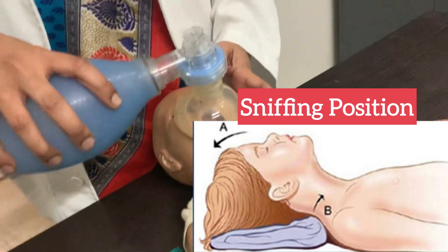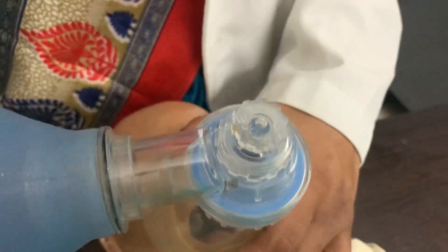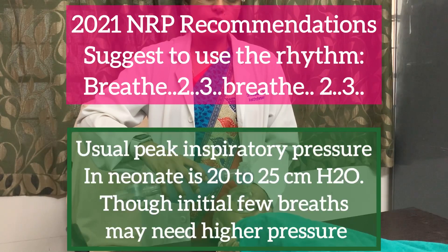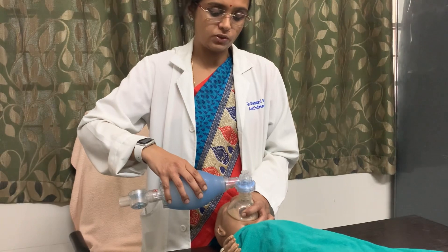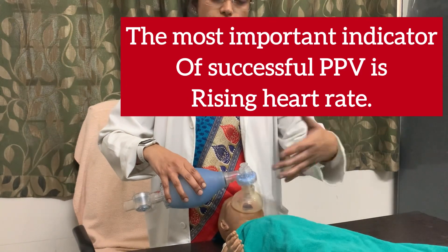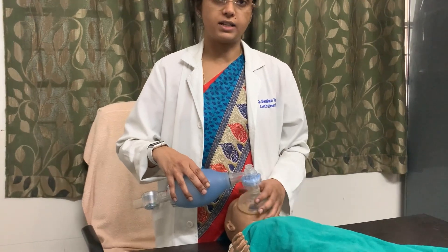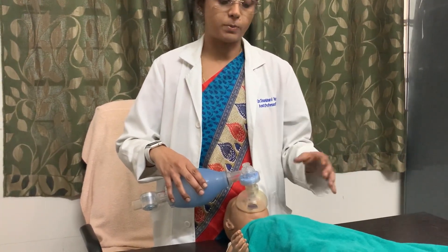Take care that the mask should not exceed the chin or compress the eyes. Count 1 and 2 and 3 and press, repeating each breath cycle. In neonatal resuscitation, an increase in heart rate — especially within the first 15 seconds — or rise in the chest during ventilation ensures that your ventilation technique is correct. Otherwise, you need to take ventilation corrective measures.